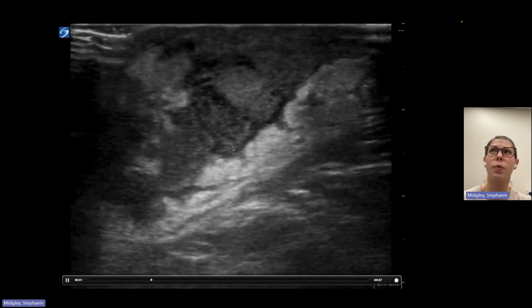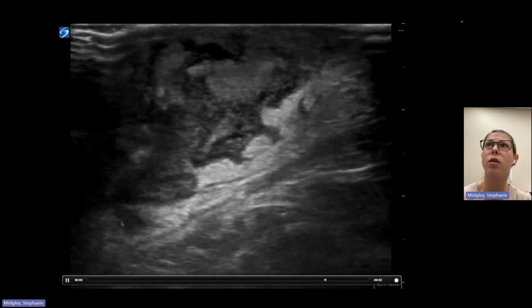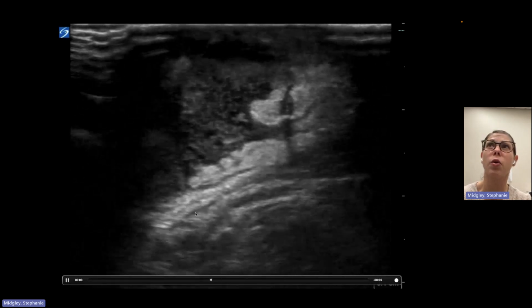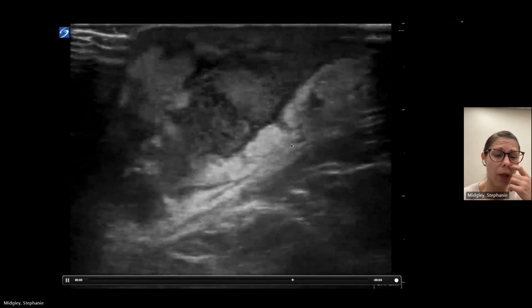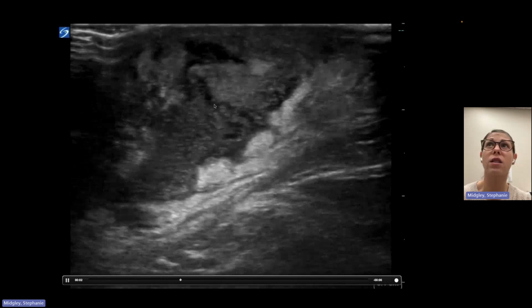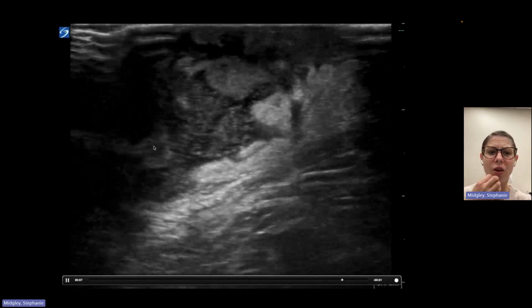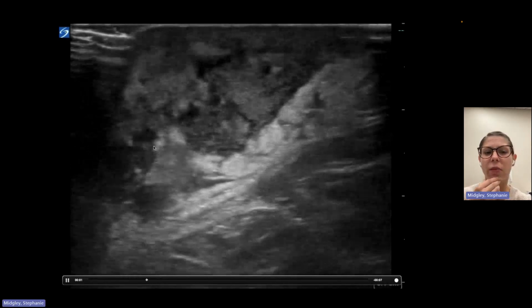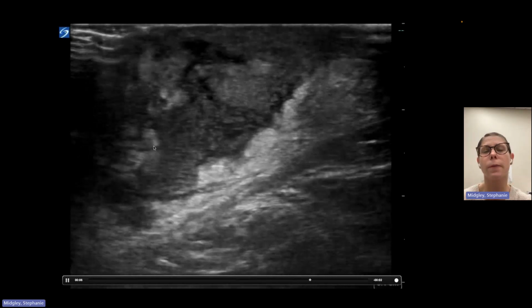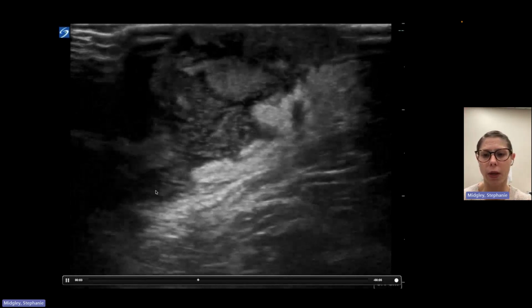So here's another example. This person should have used a little bit more depth so we can figure out how deep this abscess goes. But again, you can see it's irregular, it's hypoechoic, there's posterior acoustic enhancement. Other important things for this abscess: if I scan and this thing is huge, this is probably a pilonidal. But if I cut into it and get almost nothing out, that tells me I'm either not deep enough, I didn't make my incision big enough, or I'm not over the area of pus. So ultrasound can also help you localize the area of maximal pus from where to cut.